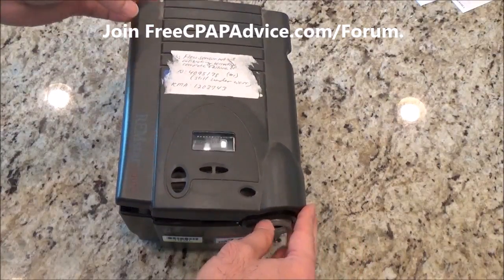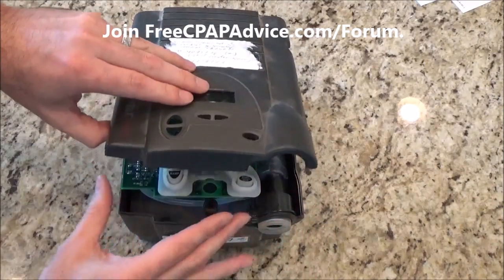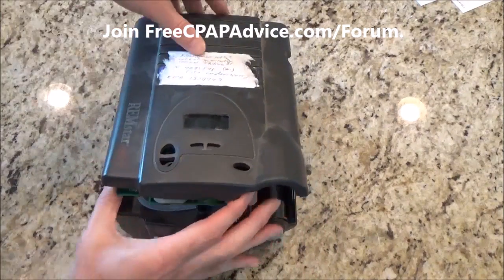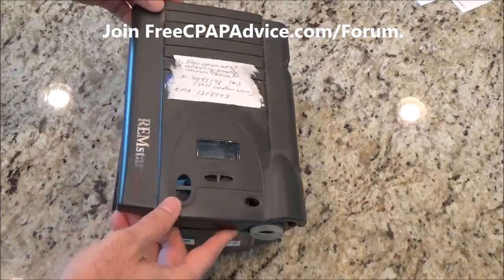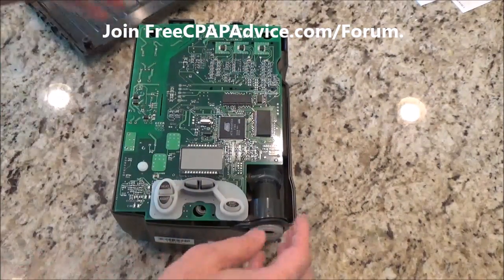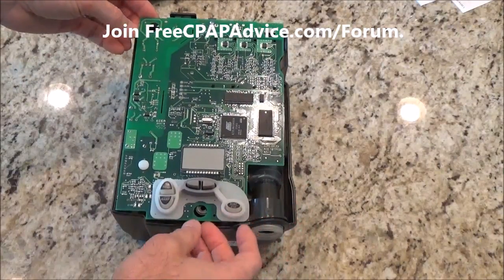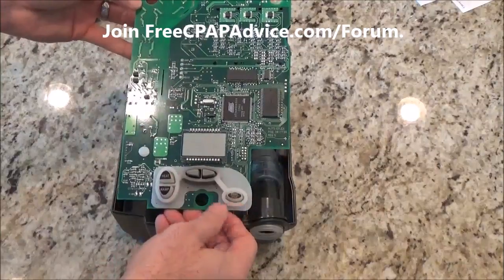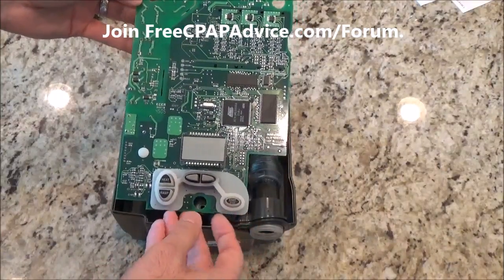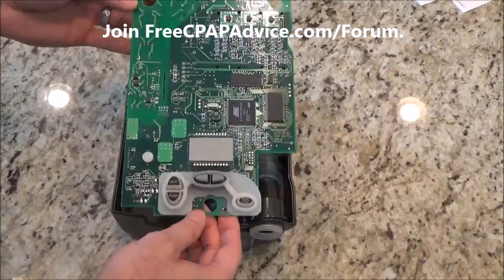I've already removed the screws, so yay. All right, so here we have the motherboard. This is the whole brains of it. And we have the LCD screen and a bunch of other components. I don't know what any of this means. We're all in this together, right?